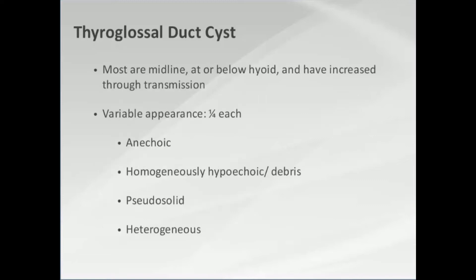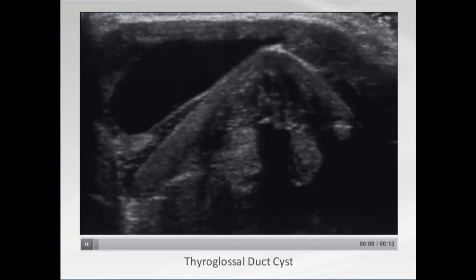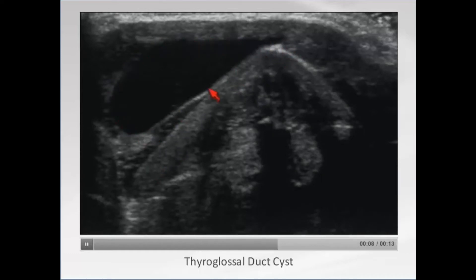Most thyroglossal duct cysts are right in the midline at or just below the hyoid bone. About a quarter of the time they're anechoic, but they can also have debris, mimic a solid lesion, or be very heterogeneous. Here's a thyroglossal duct cyst related to the thyroid cartilage — you can see it actually starts in the midline and sort of drapes over, very anechoic, very characteristic in its relationship to the midline cartilage.